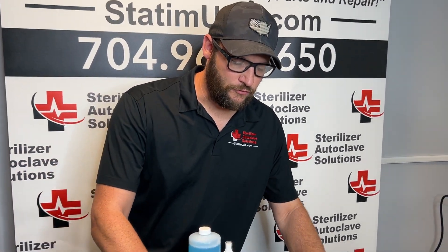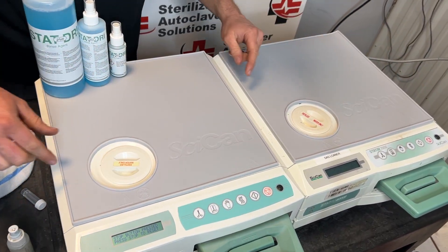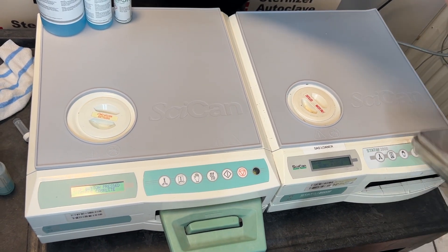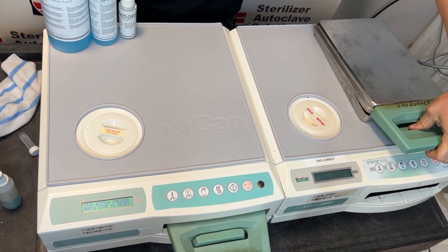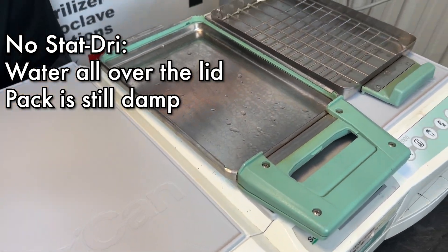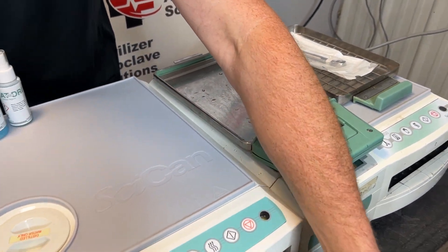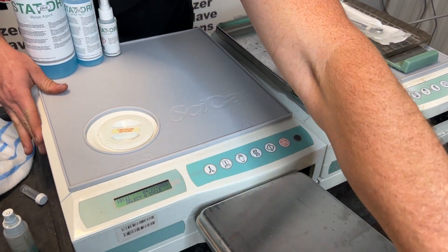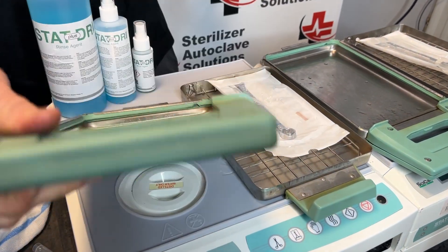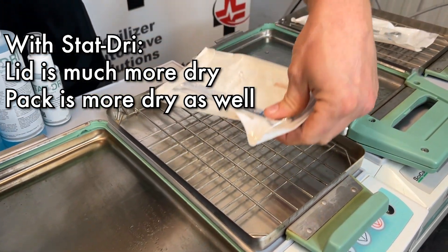And we're back. So if we look, we have been drying for just a couple of minutes on each of these. I'm going to stop each of these and pull out the one without STAT DRY first. If we notice, we have water all over the lid — our pack is still pretty wet. Now pulling out the one with STAT DRY — if you notice, our lid is a lot drier, and our pack is also a lot more dry.